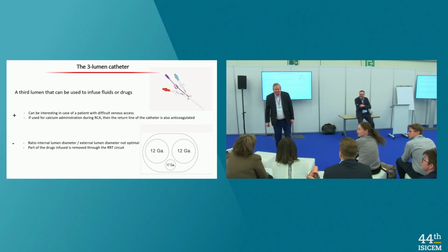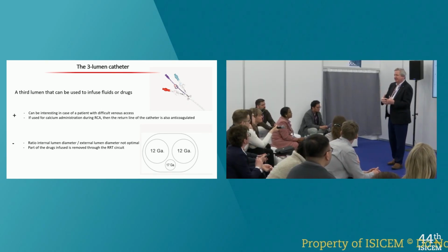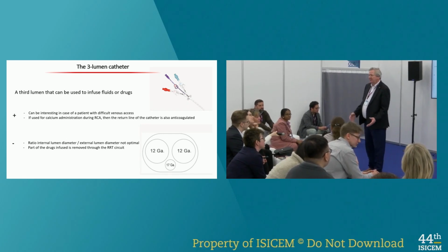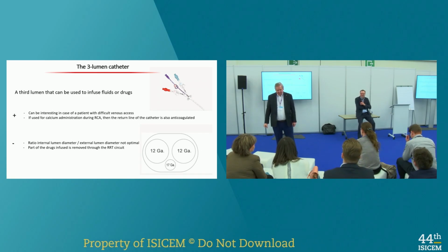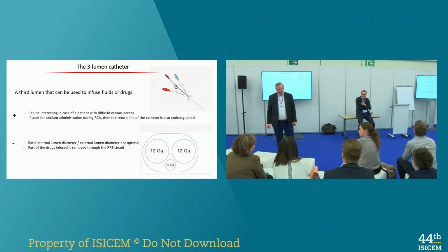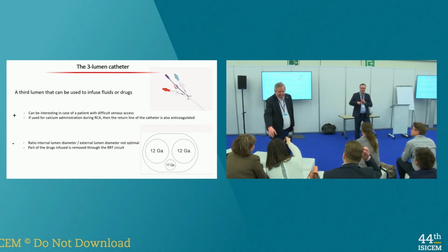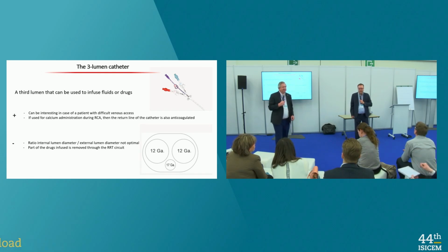Catheter in the atrium is not a good position. For what? For the patient. Yeah, but for which risk? Why do you believe it's not so good to place the tip of the catheter inside the right atrium? Thrombosis. There will be no thrombosis. The flow inside the right atrium is very high. It's the same as at the entrance. So it's not because of thrombosis.